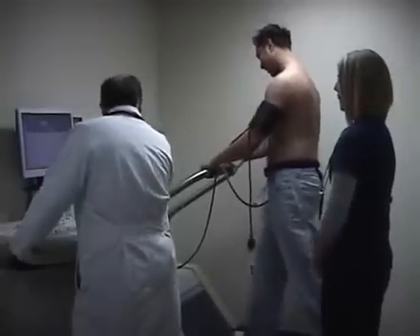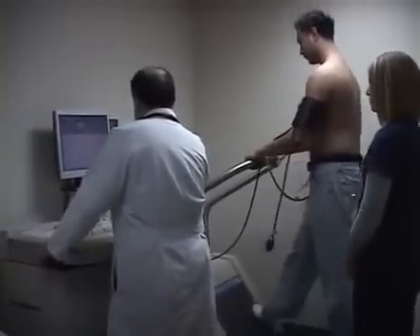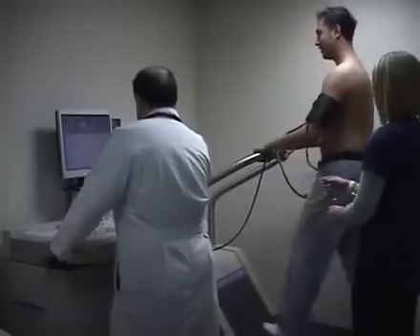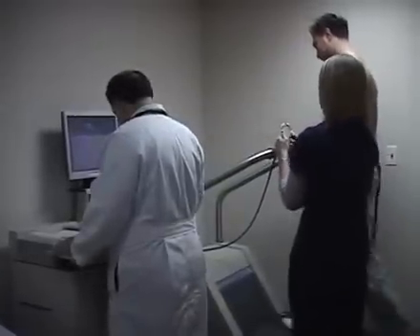Hi, this is Dr. Kavistein, cardiology. Right now we're doing the stress test on a patient who's been experiencing chest pain and palpitation. We decided to look at his heart and make sure that the valves and the walls of the heart are moving well and that there is no problem with the electrical activity in the heart.